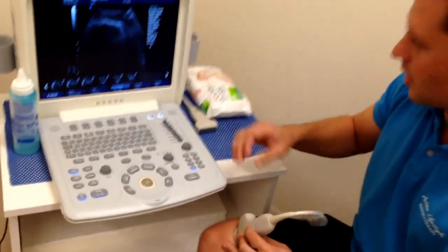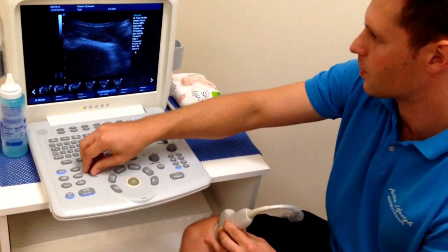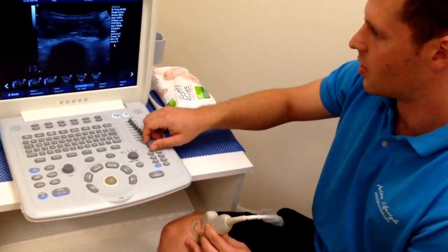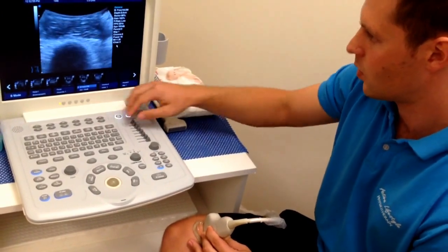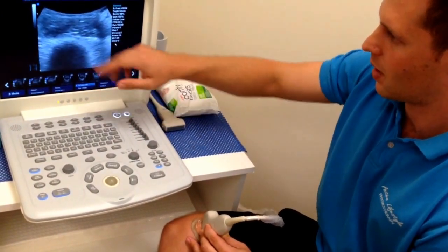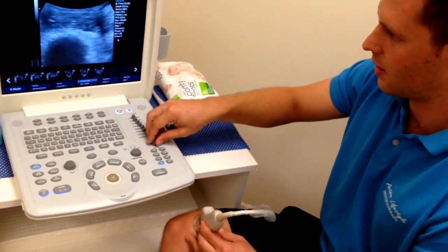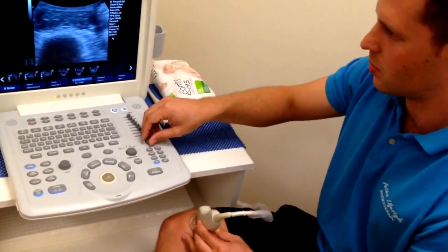We might have to zoom in a little bit. If the image is oversaturated, it becomes very difficult to see what you're looking at. So we might turn the gain down to get a little bit more definition between structures.